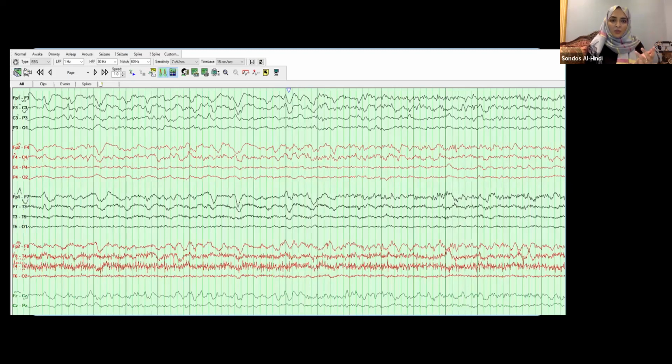So the metabolic derangement and the underlying structural problem would not be enough for me to assess fully and say that my assessment was clearly absence of all brainstem reflexes. Again, the EEG was showing a bit of an attenuation, there's a diffuse slowing, frontal predominant, which is encephalopathic.